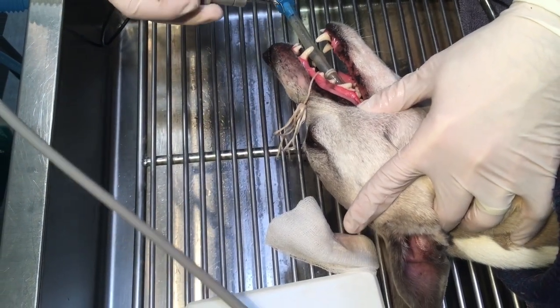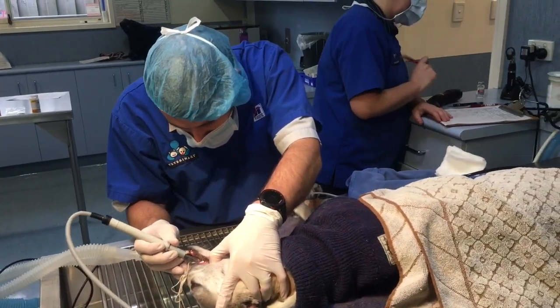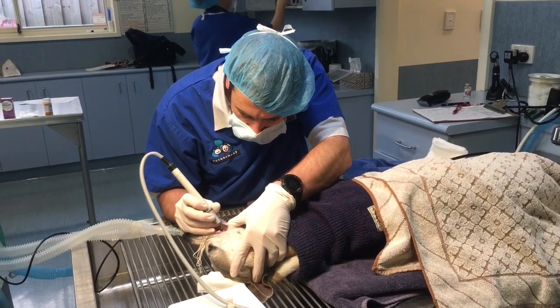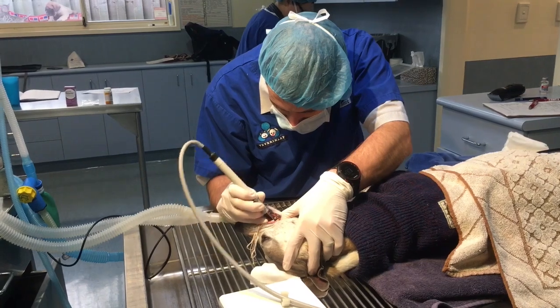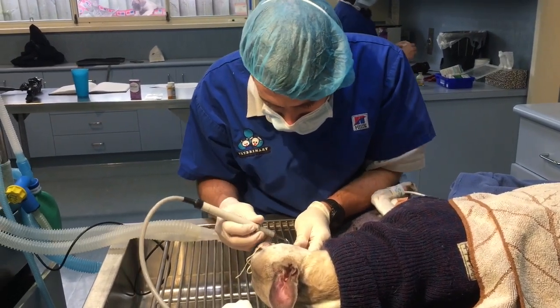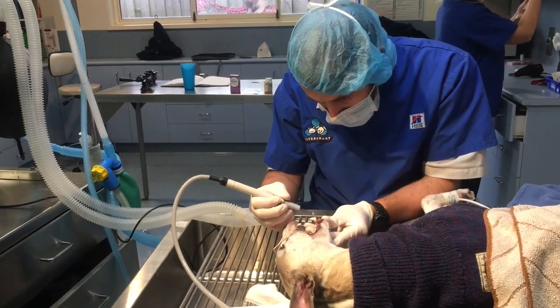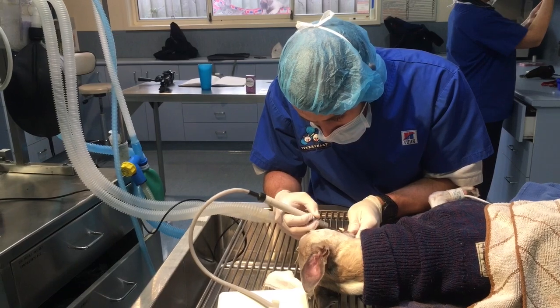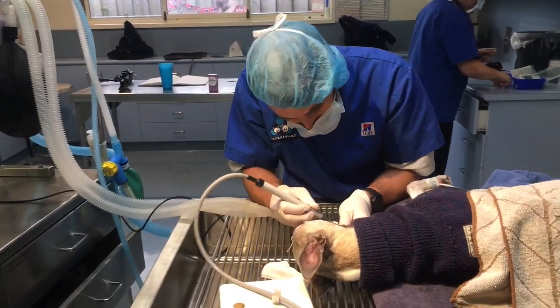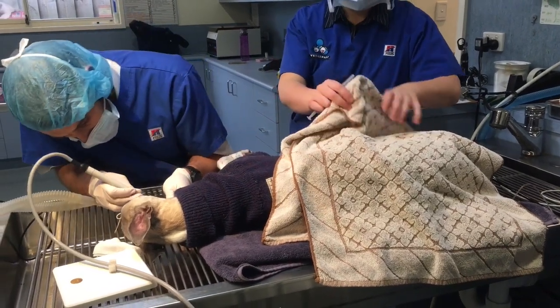I'm going to get Sarah to give her a Clavulox injection — point eight would be great. Let me just come and get that cheeky little second molar up here. The second molar is always a cheeky one — it's got these tiny little roots. Because it's got tiny little roots it doesn't take much before it starts to get a little bit of lifting. We do these procedures on our wet table so then we can have lots of things to try and help keep the dogs warm — three towels and a little hot water bottle under here for Rosie. All the liquid from the scaler can just go down into the sink in our wet table.